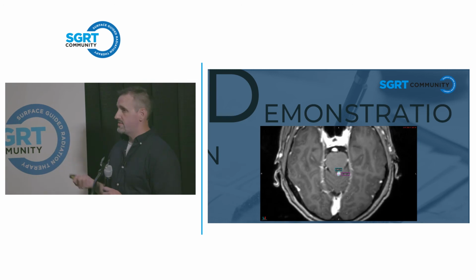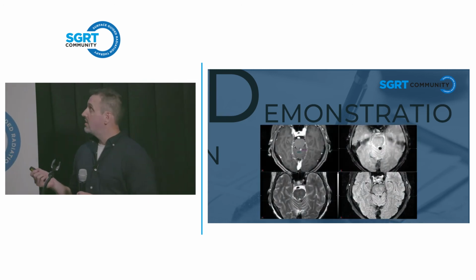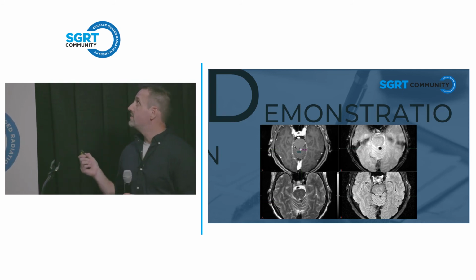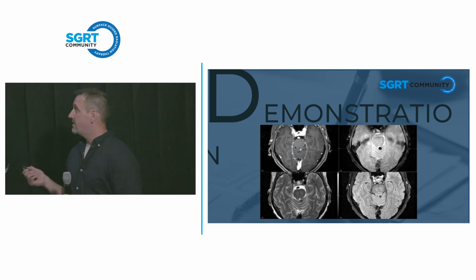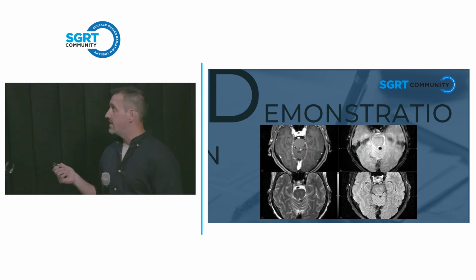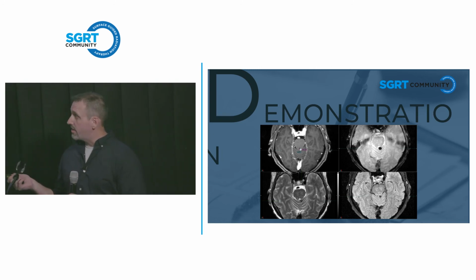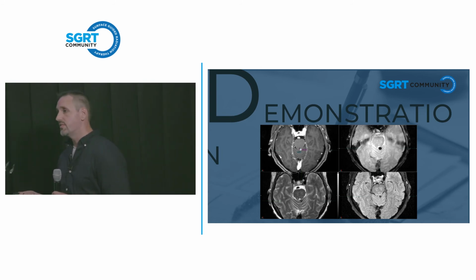This lady also has a meningioma that we're tracking. So we have the ability to see the SRS plan over here. This is what her planning scan looked like. This is her first follow-up scan. You can see the radiological scarring on the MRI. Again, in the vermis, about 6 months later, you can now see the radiological scar, but nothing going on in the brainstem. And this is her most current MRI that we're looking at for SRS of the meningioma. And you can see that there's no scarring of the brainstem.